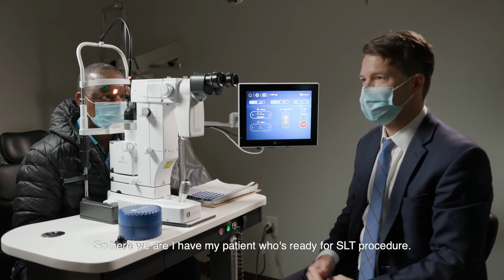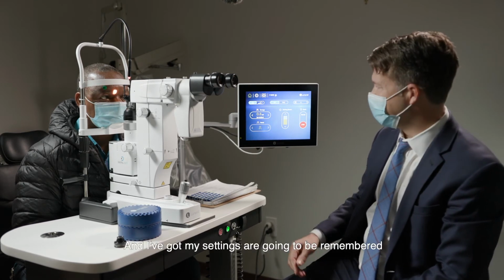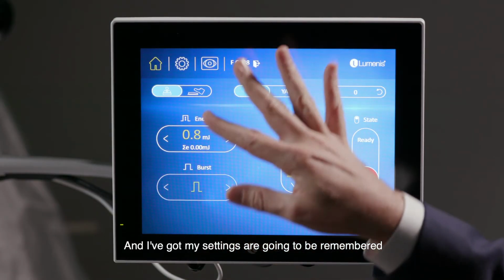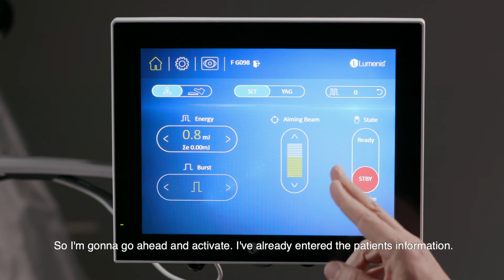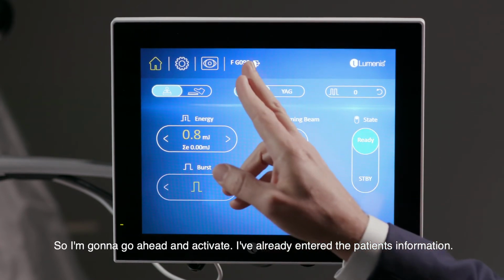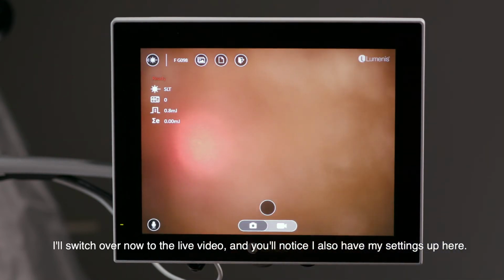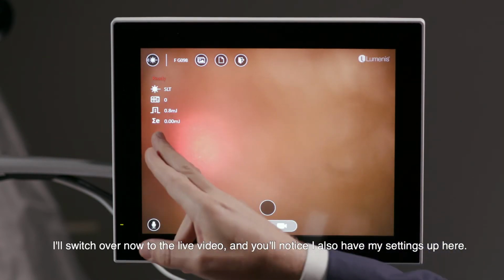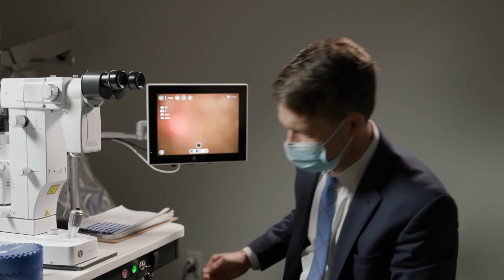All right, so here we are. I have my patient who's ready for SLT procedure. And my settings are going to be remembered from previous lasers I've done in the day. So I'm going to go ahead and activate. I've already entered the patient's information. I'll switch over now to the live video. And you'll notice I also have my settings up here. And we're ready to perform the laser.